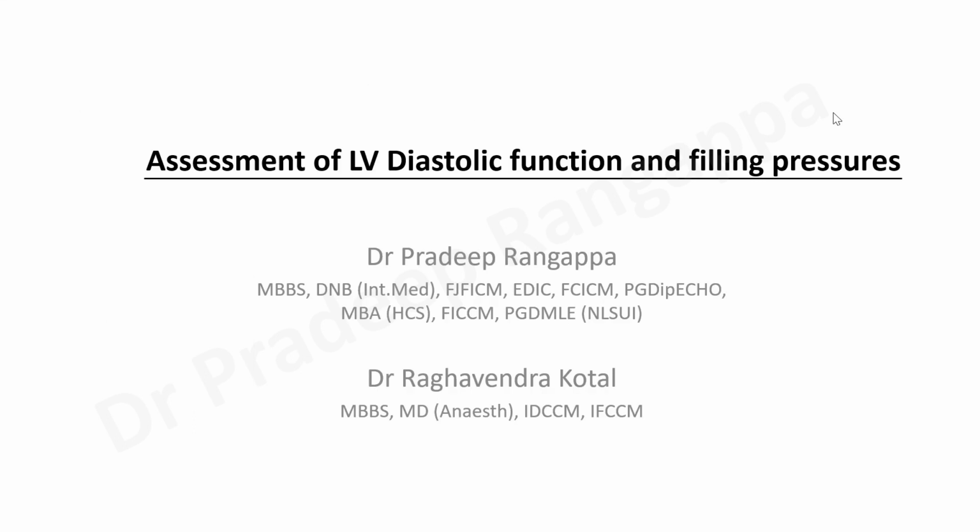And increasingly, we are seeing in ICU that many of the patients come with heart failure symptoms with preserved ejection fraction, where we need to ascertain the diastolic function and the filling pressure. So maybe in the next 10 minutes, I'll just take you through this overview. So, wish to acknowledge my colleague, Dr. Raghavendra Kotal, who helped me develop this content.